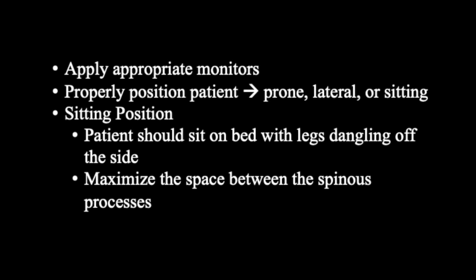Apply appropriate monitors. Properly position patient. The patient can be placed prone, lateral, or sitting. However, this video will demonstrate placement in the sitting position. The patient should sit on the bed with legs dangling off the side. To maximize the space between spinous processes, the patient should arch the back into a C shape.